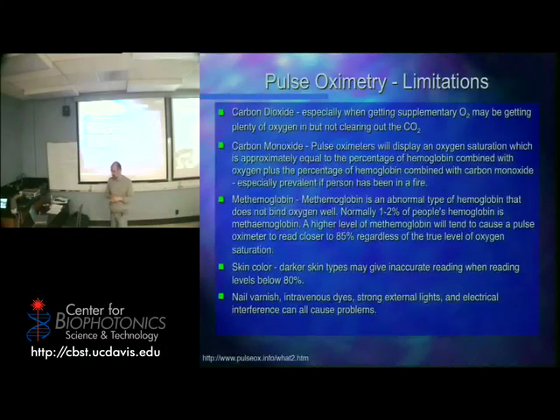So you're asking, why don't we have a pulse oximeter that measures the CO2 in the blood? Why do we say it's the O2? The body looks for CO2 naturally. The body needs the O2, but the CO2 is waste that we need to get rid of. The body uses CO2 to measure, like, if you're running out of breath, it's the CO2 concentration, that's the absence of oxygen. If you're running out of breath, you're trying to figure out.